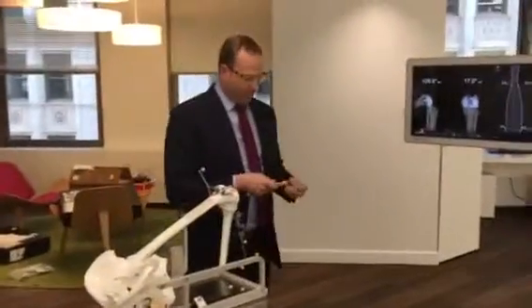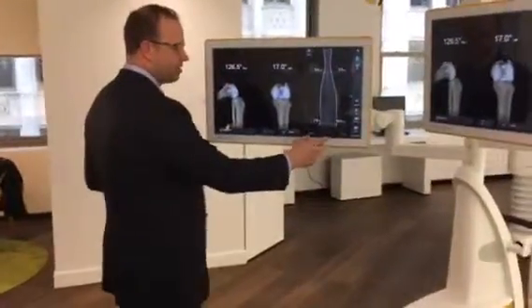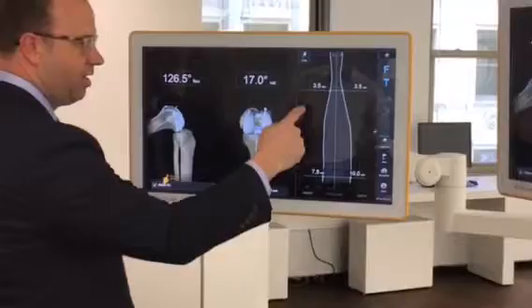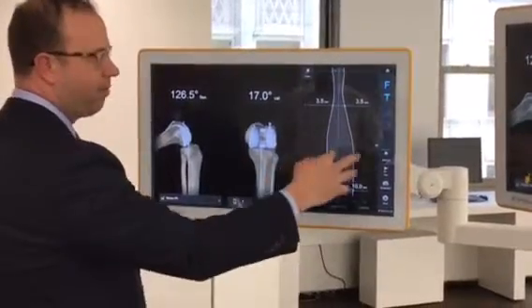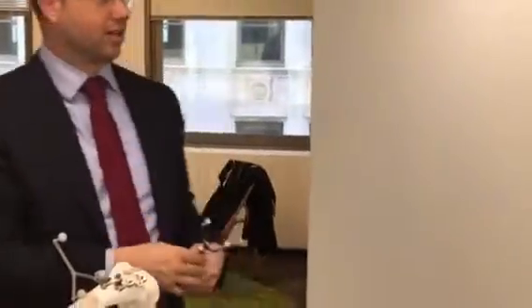So if you look here, we have a graph that has medial and lateral collateral ligaments, 0 degrees flexion, 90 degrees flexion, 60, and for the first time ever, this anecdotal mid-flexion. Where we used to talk about or think about mid-flexion instability, for the first time ever, we can now see it, visualize it on screen.